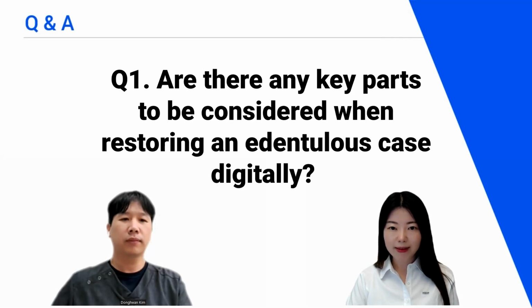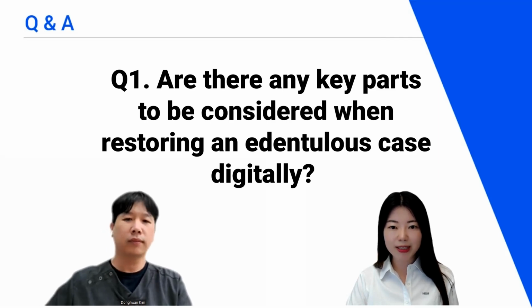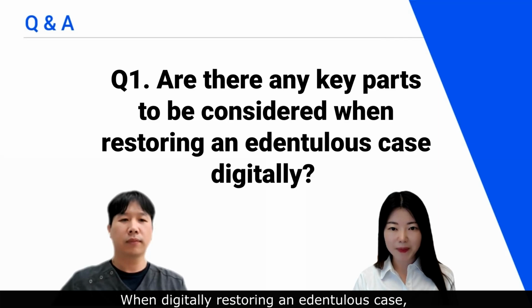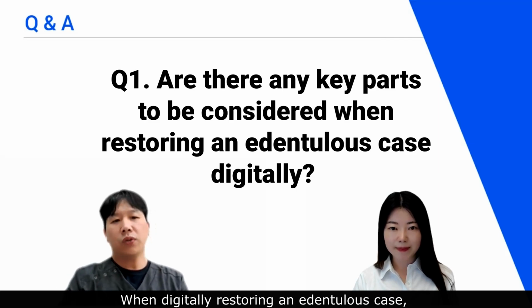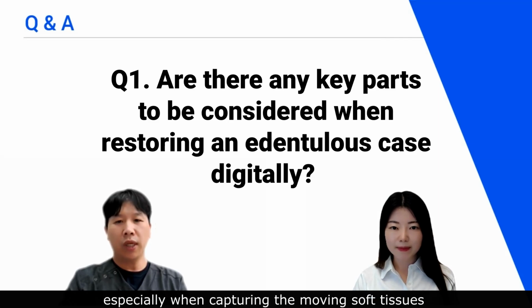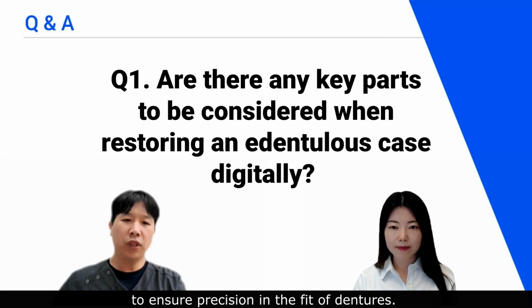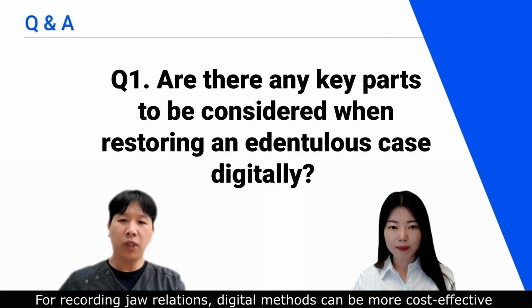Question number 1. Are there any key parts to be considered when restoring an edentulous case digitally? When digitally restoring an edentulous case, it is crucial to use high-resolution scanners with care, especially when capturing the moving soft tissue, to ensure precision in the field of dentures.